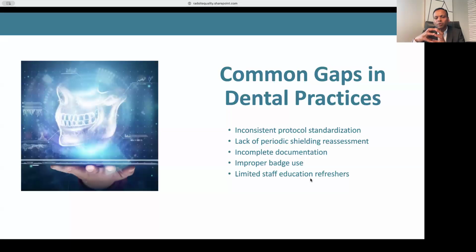Depending on that, and even without mentioning that, either way, safety should be at the core of your radiation safety program. So I want every facility to take a team approach, because radiation safety is everybody's responsibility. You cannot just blame somebody for not doing the job. For that reason, the leadership should be more open to communication rather than being punitive.